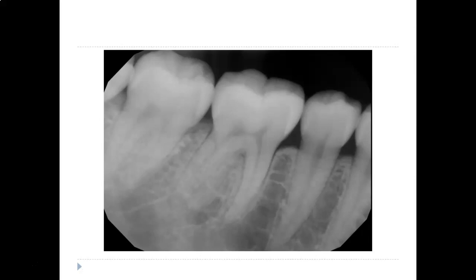and you can't just always say, I'm just going to take a pano on everybody, because for one, that's a lot of radiation to take a full mouth series and then on top of that take a pano. Do we do it sometimes? Yes, we do it sometimes, but should we just have that be our answer for every single person who doesn't want a sensor or can't handle a sensor in the back of their mouth? No, we shouldn't. So this I thought was genius, and I can't wait to, like I said, try it out.